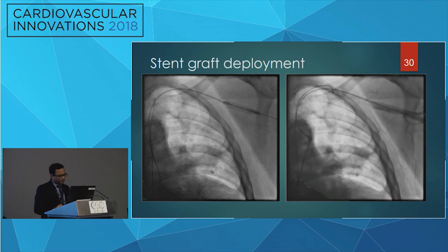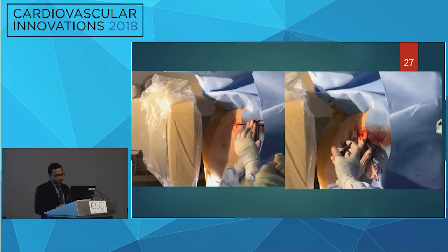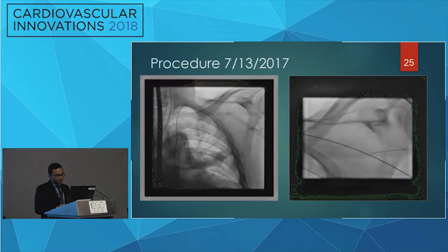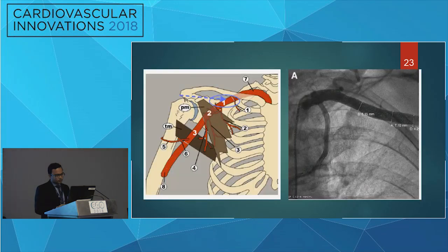The angle was right, and I may have missed it in your presentation, but why did you guys choose axillary access versus a true subclavian access? What was the issue? Was there stenosis somewhere, or why did you go in that very dangerous area on purpose? Why did you choose axillary instead of the traditional subclavian access closer in? I thought this distal approach allowed a percutaneous approach without a cut down.